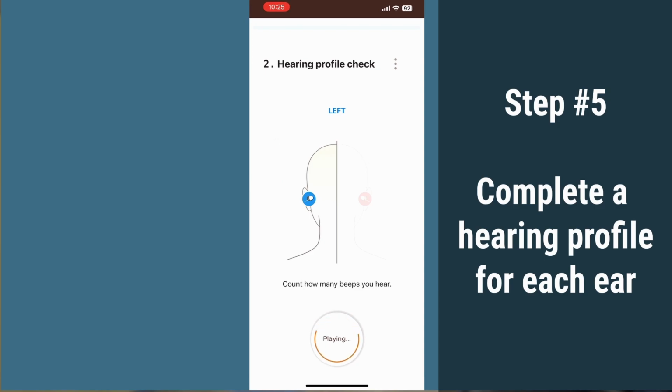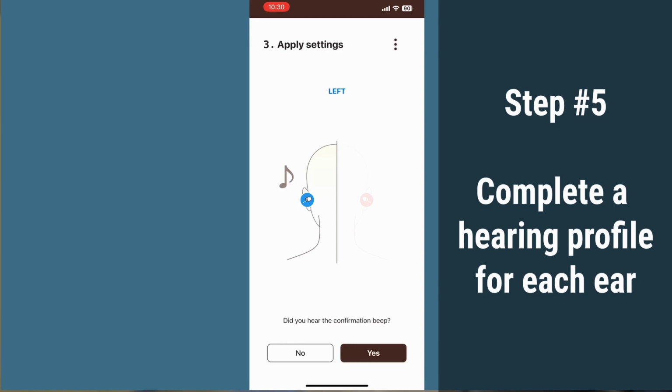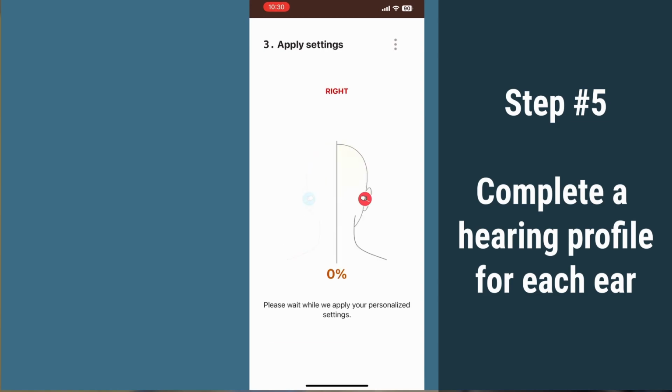Once you've indicated whether you heard 0, 1, 2, 3, or 4 beeps in each ear, it's then going to apply the hearing profile. Applying the settings right now on the left. Okay, that looks good. And now we're going to do the same thing to the right. We're applying the settings on the right side.